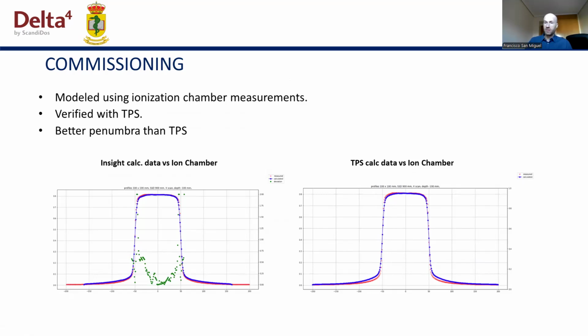In our own experience, this discrepancy is not particularly significant in VMAT cases. However, in 3D conformal radiotherapy treatments, those differences can be observed at the field edges.